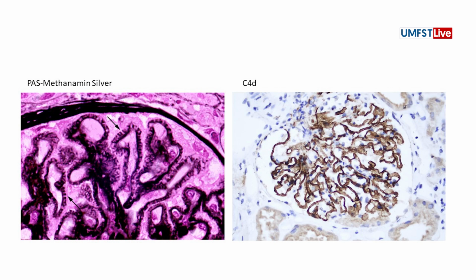This is very fancy for membranous nephropathy, the silver staining. I would like to put it the same because they are like yin-yang. Because these areas, not black ones, are here brown. Because this is the immune complex, just on the GBM, just like small nodules. It's like pearl-like nodules. That's why it's fancy.